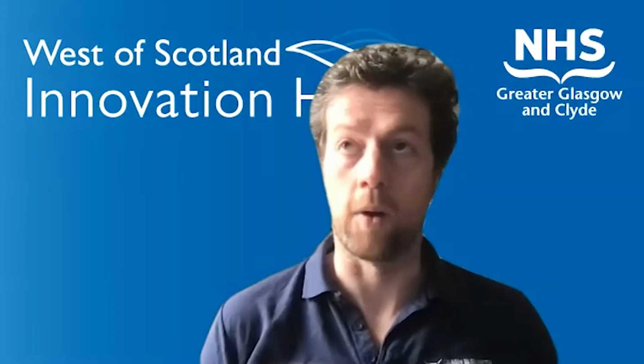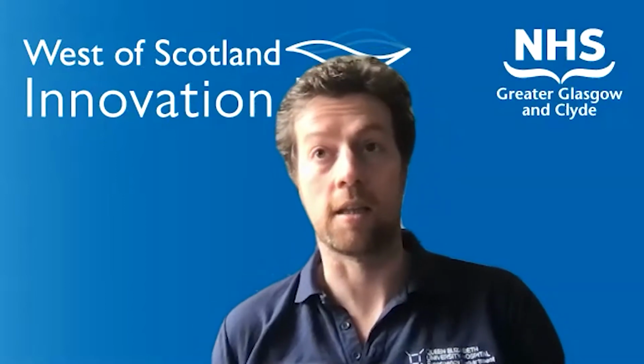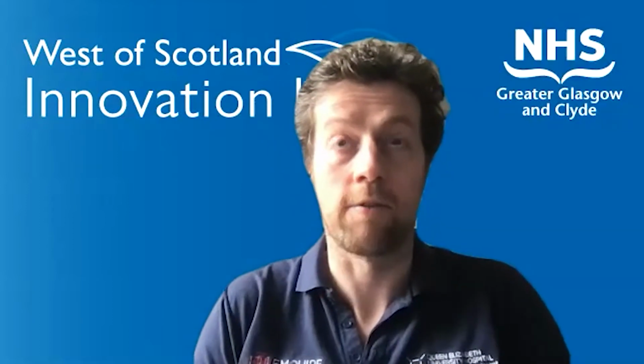Yes, I think it's important to say that the collaboration we established before Work Package 6, specifically within iCAIRD, was focused on identifying radiological signs and prioritizing abnormal X-rays to be reviewed and reported and surfaced to the clinicians that requested them. Because of the work we've done, both in terms of interpretation of a huge number, 1.1 million chest X-rays within Greater Glasgow and Clyde, and also validating that against publicly available data sets from a range of other countries, it was relatively easy to pivot towards COVID as a response. We had a very clear point of starting to see COVID presentations within Greater Glasgow and Clyde, and indeed within Scotland, that allowed us to identify those X-rays that were abnormal and related to COVID because we started to do PCR testing of those patients.